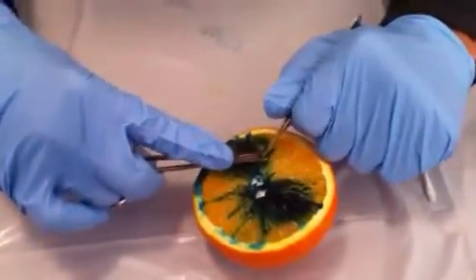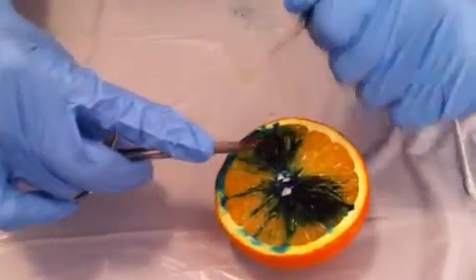I keep the scissor in the upright position. I cut the flap and there you go.